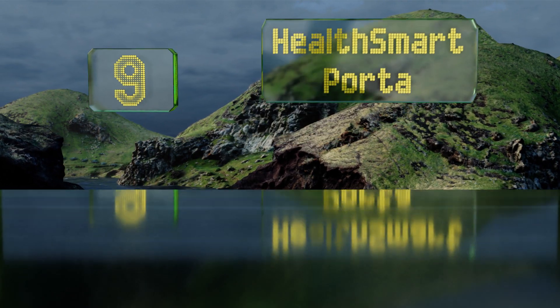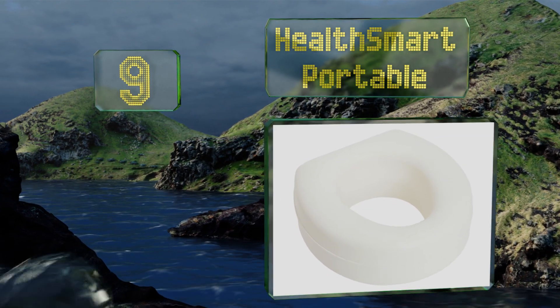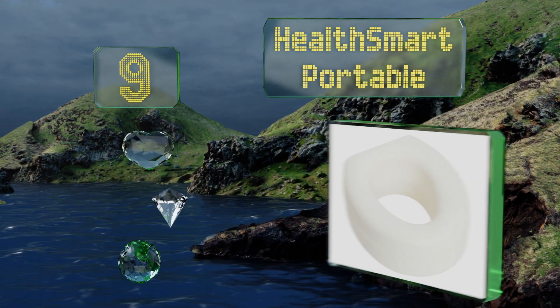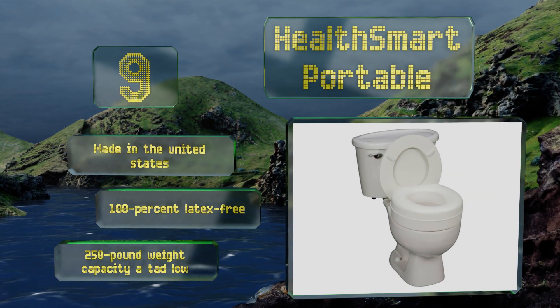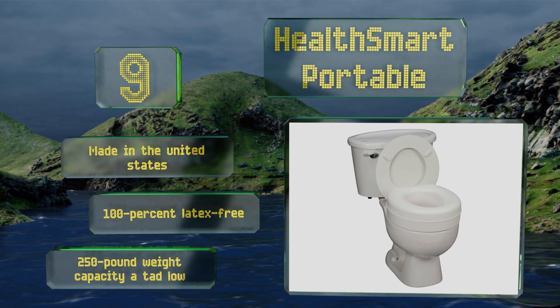At number 9, the HealthSmart Portable is a cost-effective way to add 5 inches of height to your current commode. It's probably best for those who are a bit more independently stable on their feet, though, as it only adheres with four slip-resistant pads. It's made in the United States and is 100% latex-free. But its 250-pound weight capacity is a tad low.